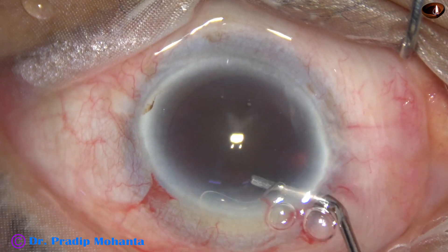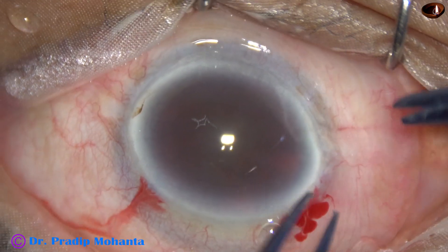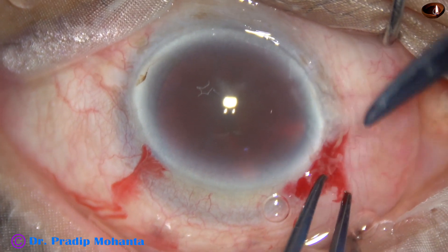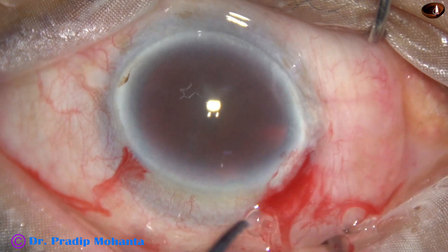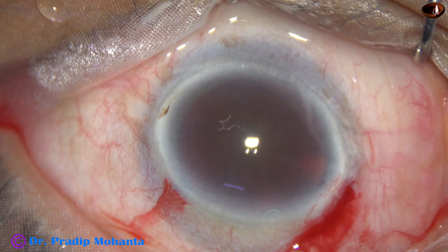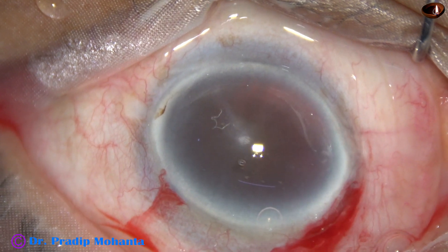So after injecting some visco into the anterior chamber, I take a scissor and do a small peritomy so that conjunctiva chemosis doesn't occur. In this case, the conjunctiva has engrossed onto the sclera a bit.